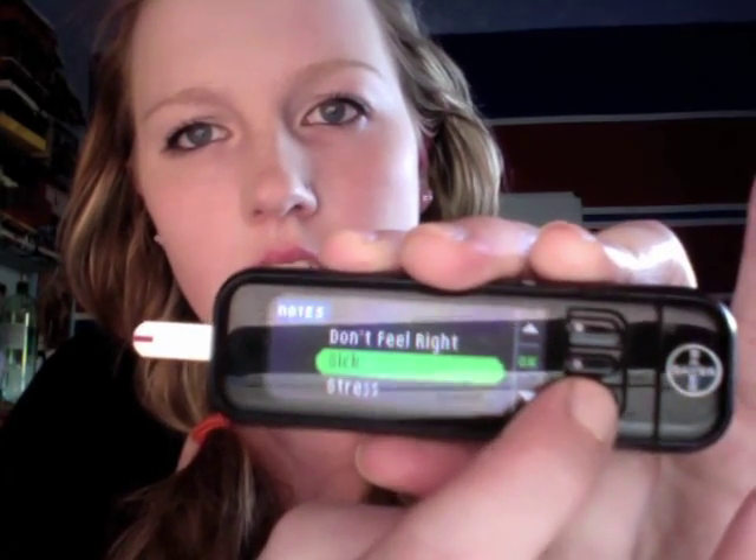And if it's low, it's also orange. And if it's within the normal range, it's white. So that's really good. You can also set a reminder — so if I want to test in another two hours, I can press that button there. Or if I have notes, I can choose between: before meal, after meal, don't feel right, sick, stress, or activity.